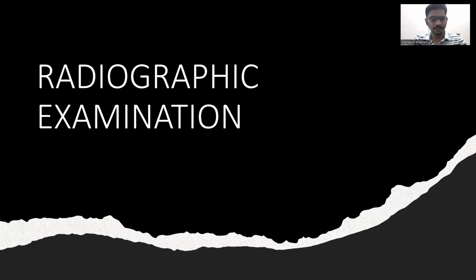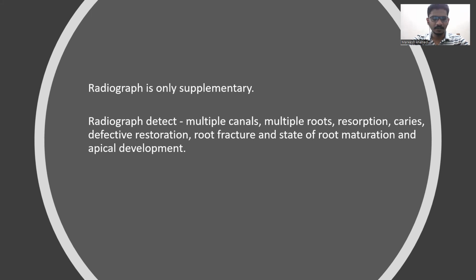So we completed the pulp vitality testing. We'll move on to radiographic examination. Radiographs are a very important adjunct to clinical diagnosis. But one thing which we need to note is that radiograph is only supplementary.